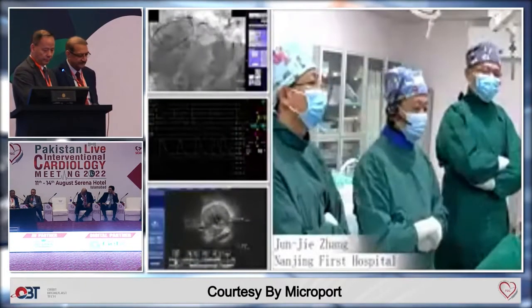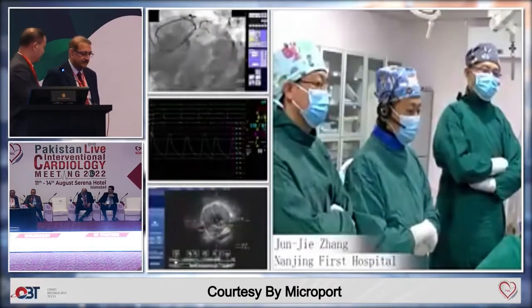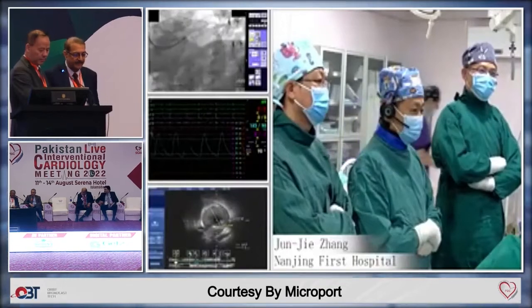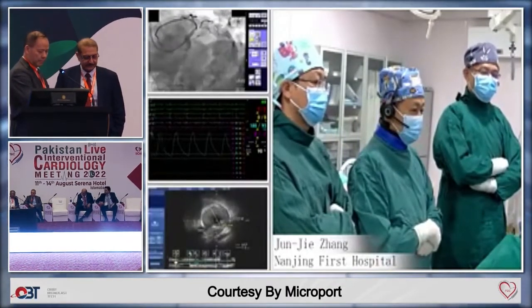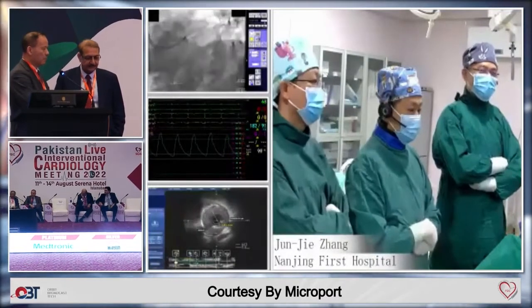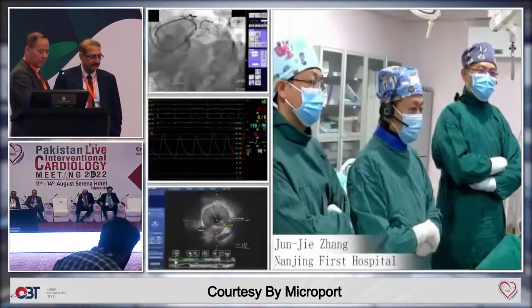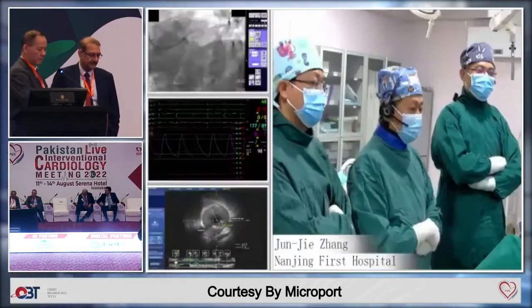Okay. So the interesting lesion, very classic of Nanjing, a distal left main bifurcation stenosis. So we already defined lesion complexity. Based on the algorithm we published, this is a complex lesion and you're going to do a 2-stent technique. The issue is the origin of the marginal, whether you're going to leave it alone as part of your strategy or do some modification of the plaque of the ostium before you do a 2-stent strategy.